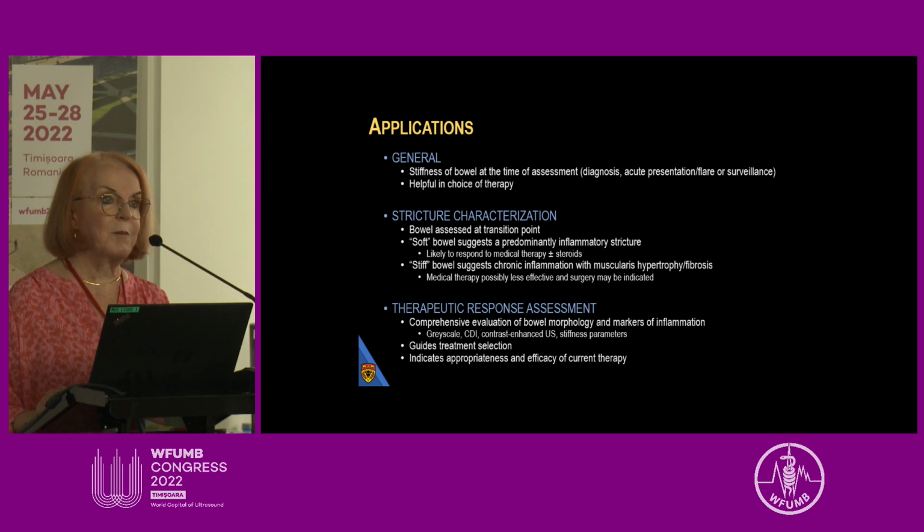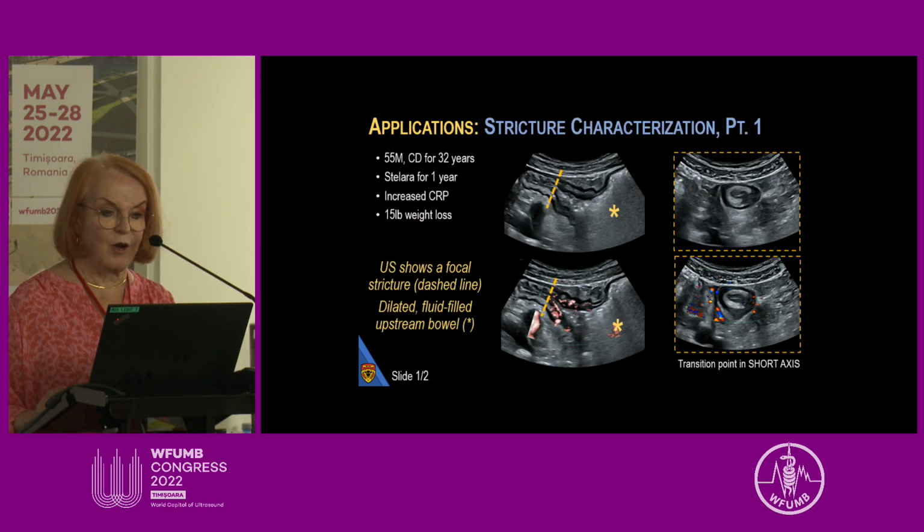And of course, we compete here very strongly with MRI. And I think that our technique is more based in good science than MR, which is looking at interstitial contrast agent because of the difference in microbubble contrast and MR contrast.